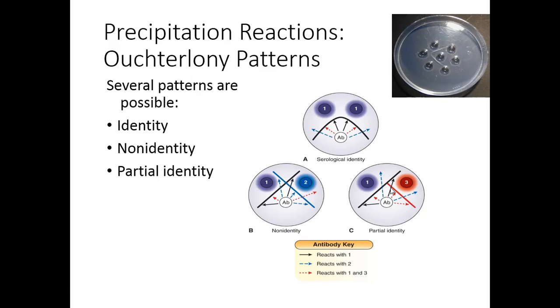So let's look at, I got a little ahead of myself. Let's see, did I want to say anything about this? Multi-specific antibodies diffuse out. So the arc of precipitation, I think I said, is that both the known and the patient are the same. So whatever we put in here for the known antigen, we have the same patient antigen. So we can identify what this patient has for an antigen.